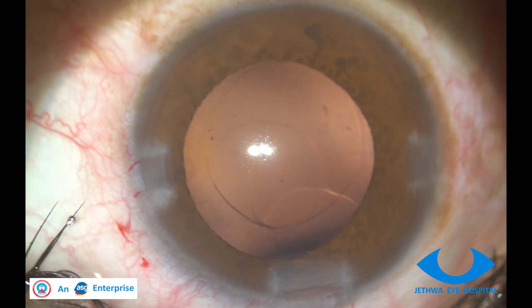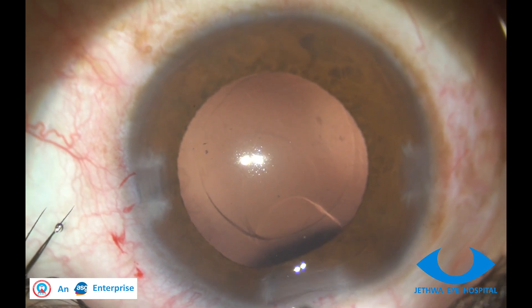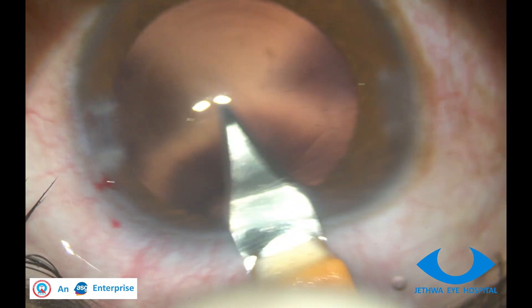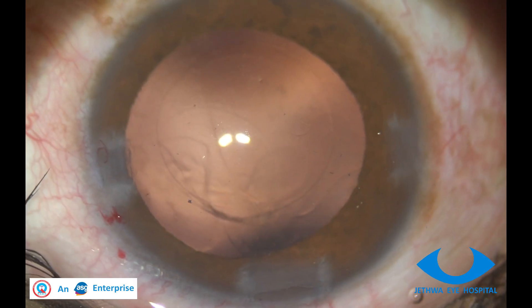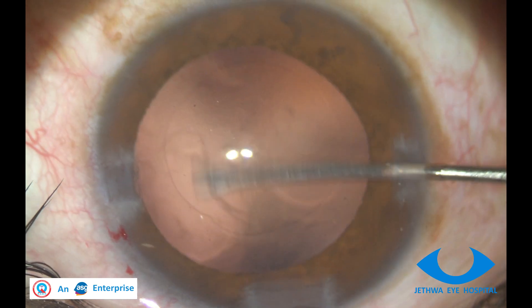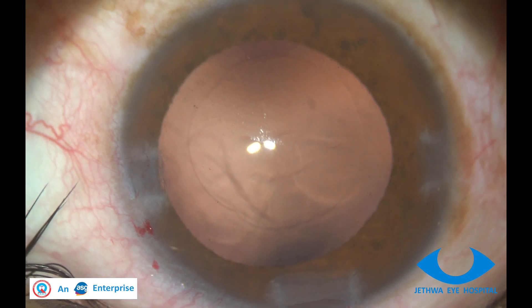It is better to push a little bit of vitreous which is projecting into the AC, and first confirm that the wound is without vitreous. Better to enlarge the wound and try to swipe away to see the extent of vitreous in the AC.